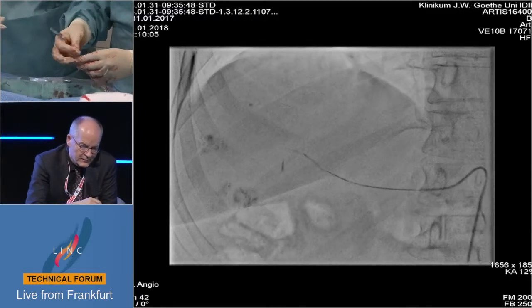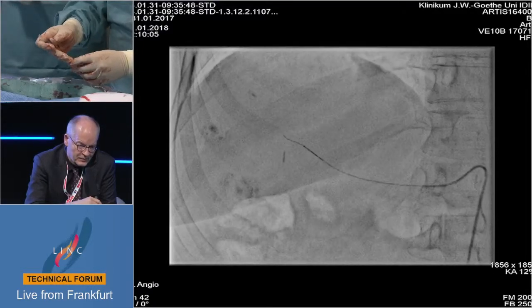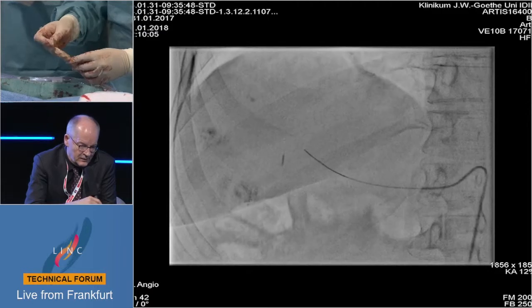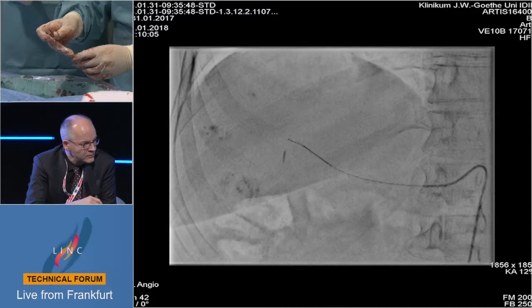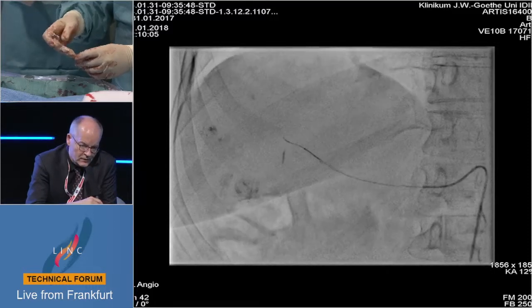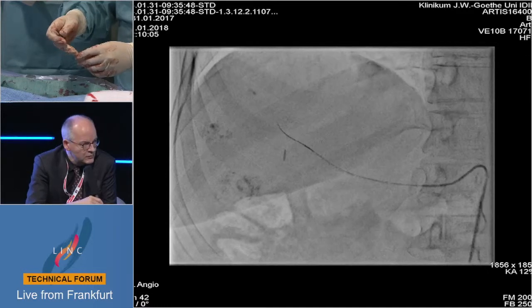In this patient, for example, our intention would be to perform 3 TACE procedures, and maybe then it's a candidate either for radioembolization with a really segmental ablation, with a high concentration, or we try to ablate it with microwave ablation, RFA, laser, or whatever.